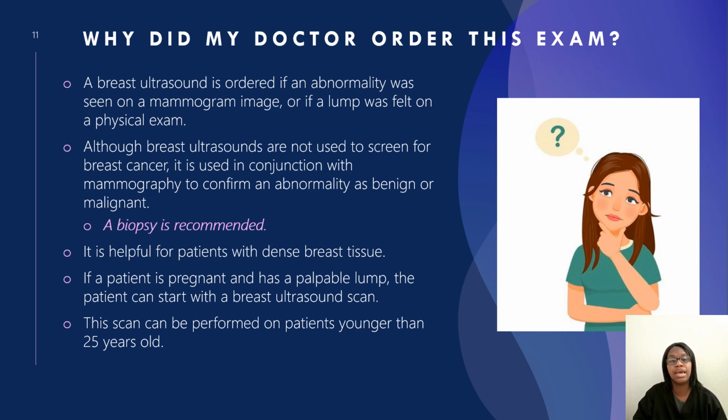And then you also have that it is helpful for patients with dense breast tissue. If a patient is pregnant and they have a palpable lump, which is a lump they can feel, then the radiologist may suggest for the patient to start with breast ultrasound. That's why we always just check with the patient or the radiologist first to make sure that, hey, the patient is this age, they said they're pregnant, so would you like for us to do a mammogram first or breast ultrasound? And then this scan can be done and performed on patients younger than 25 years old.